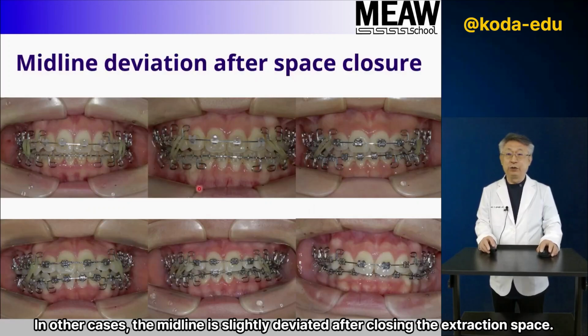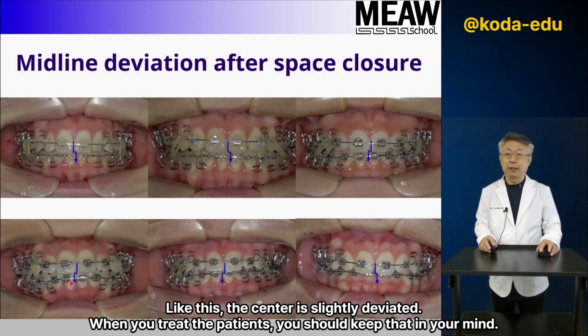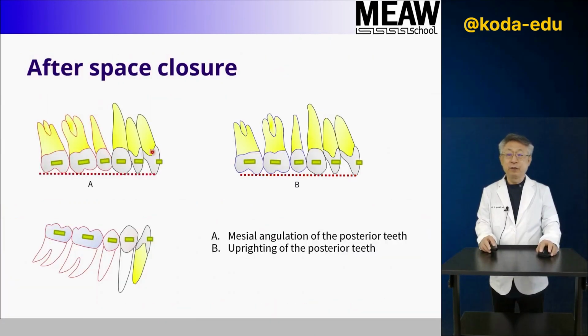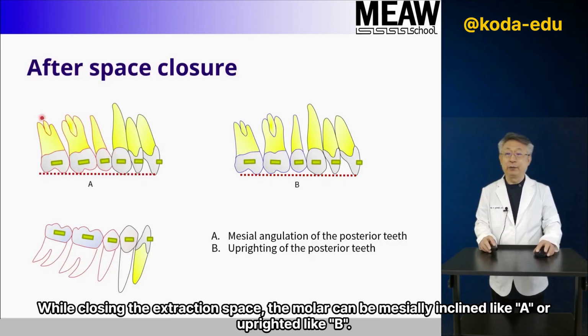In other cases, the midline is slightly deviated after closing the extraction space. Like this, the center is slightly deviated. When you treat the patients, you should keep that in your mind. In this case, we should consider not only aligning the occlusion, but also checking the midline. While closing the extraction space, the molar can be mesially inclined like A or uprighted like B.